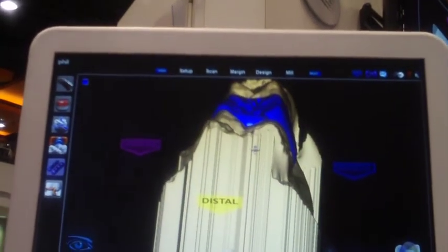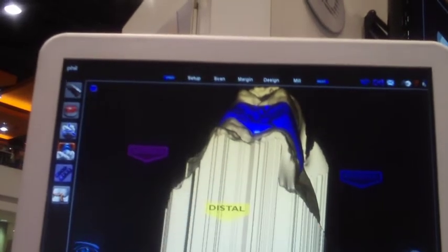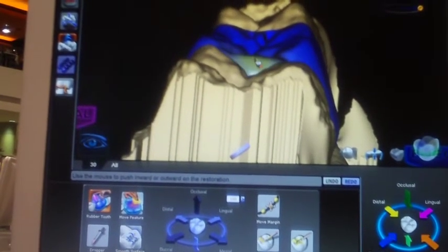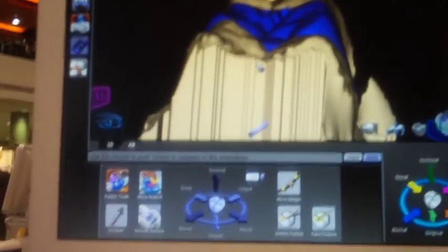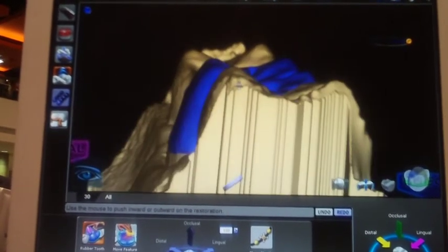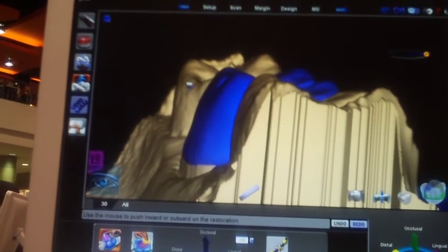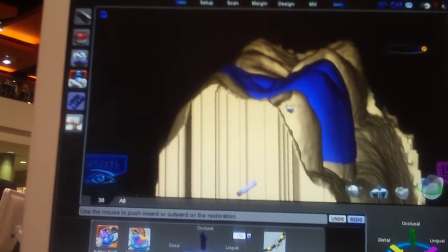Once I'm happy with the general position of the tooth I get into my free-form or finishing detail tools. I can see my marginal ridge on the distal is high so I need to fix that. We have a dropper which is a waxer, smooth surface, and digital soft-flex disc. Seeing my emergence profile and being able to move my margin with the tooth on my prep ensures good marginal integrity. This little rubber tooth here is what I do most of my work with — my marginal ridge is high, so I just grab it and pull it down. If the lingual surface isn't convex enough I can grab it and pull it out. All click and drag.